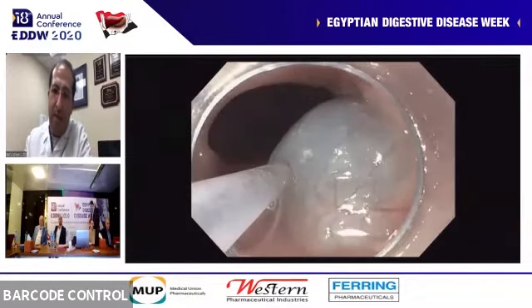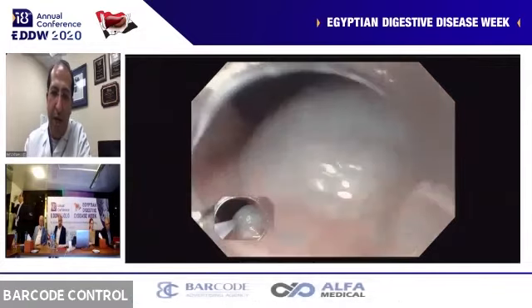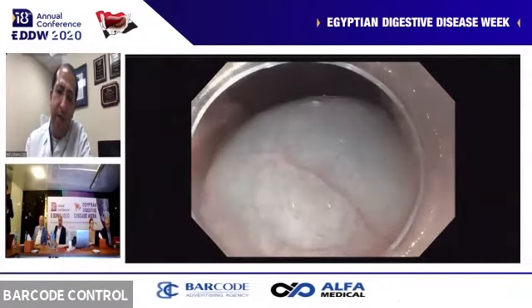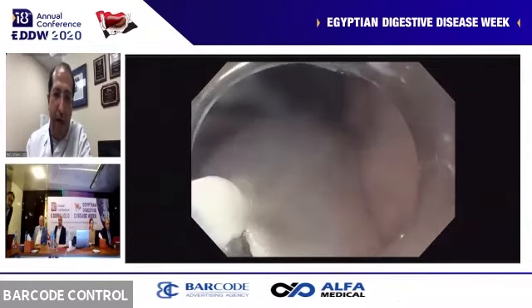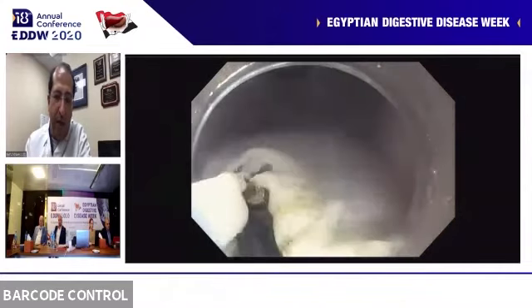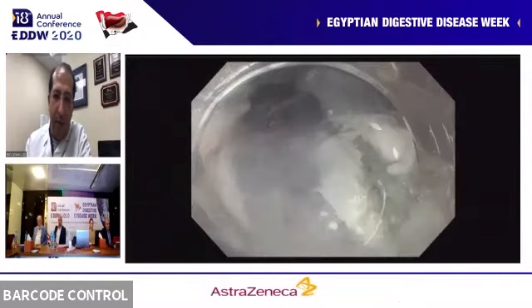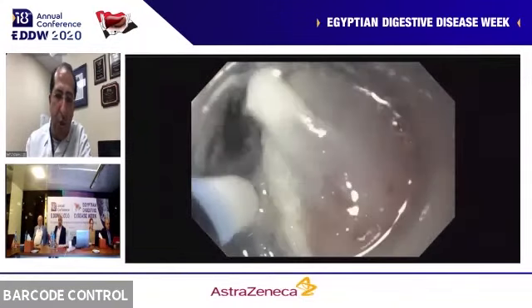I'm doing my submucosal bleb. I have to do a nice and full injection. Here I use 3% hetastarch and saline and methylene blue. Do not use any epinephrine in your solution when you inject into the tunnel. This is my entry point. As you can see, I use a lot of dissection to widen my entry point.